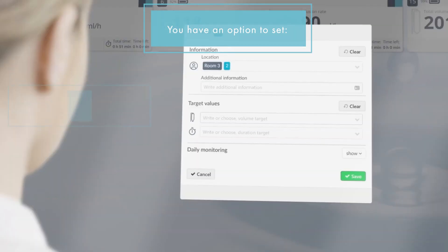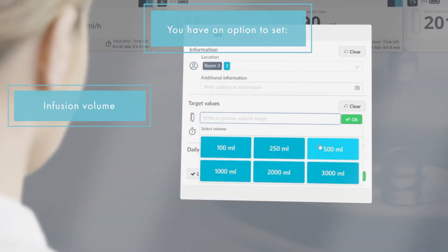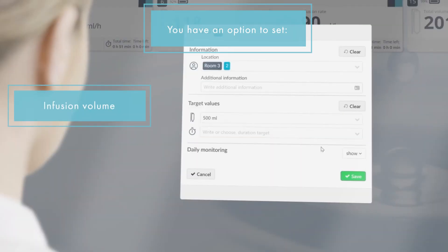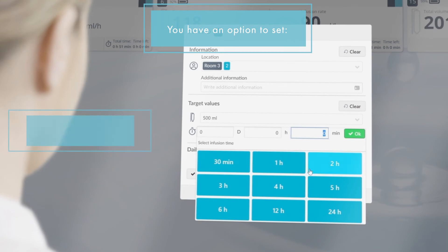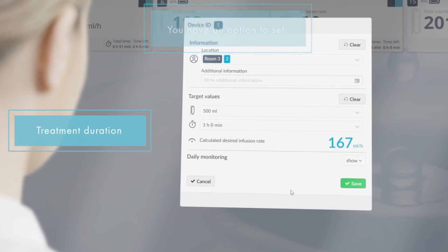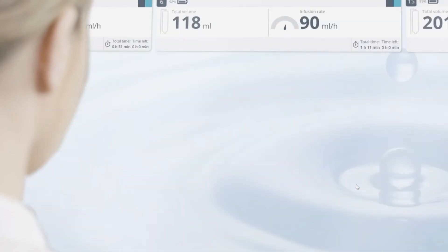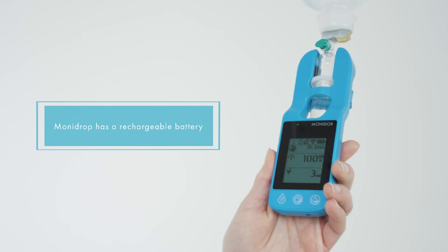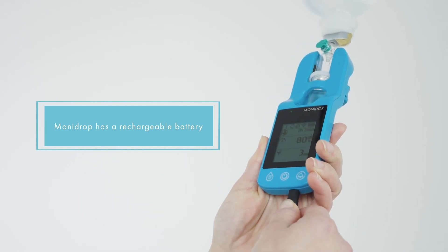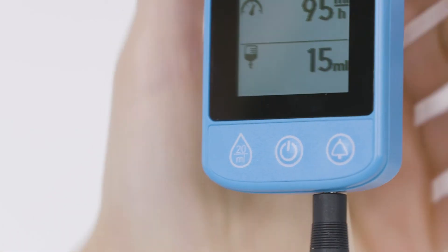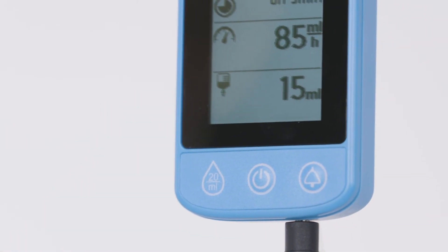There is an option to set the target values for the fluid volume to be infused and the treatment duration. MoniDrop has a rechargeable battery, and the device can also be used while it is charging.